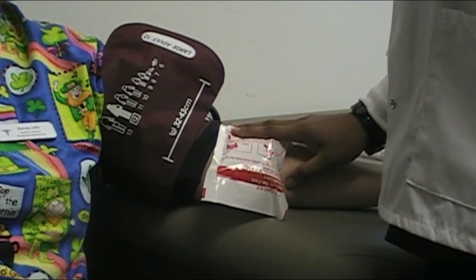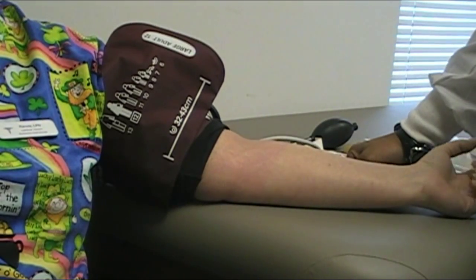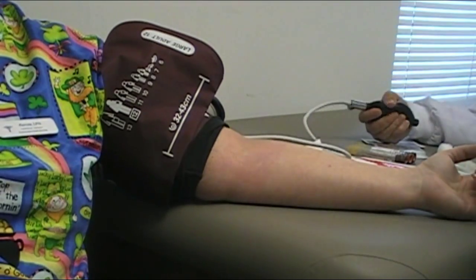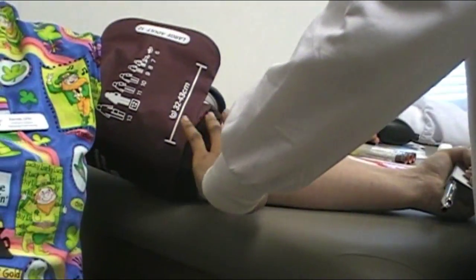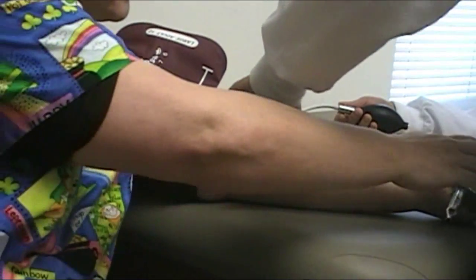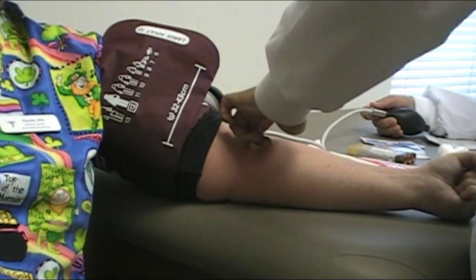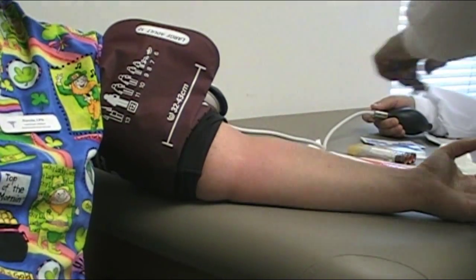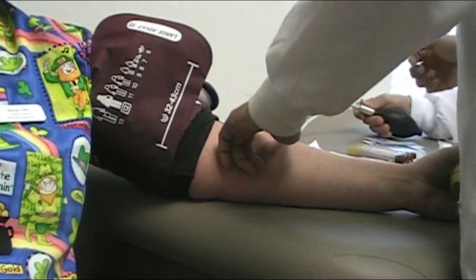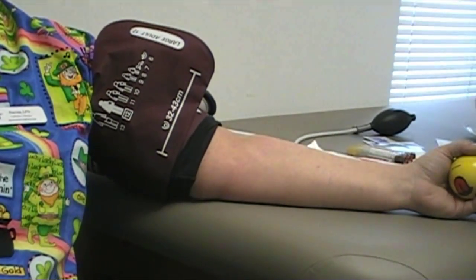Open, close, open, close. Now stop — you're going to pump that blood pressure up. Pump it up to about 85, just for a few seconds, and see if you can find that vein. Grasp and hold. Now just see if you can find one. Right here — got it. Thanks. Let's make sure we don't have the tourniquet on too long. If you found one, take it off. Just take the pressure off. A lot of difference — it disappeared. That's exactly why we're doing this.